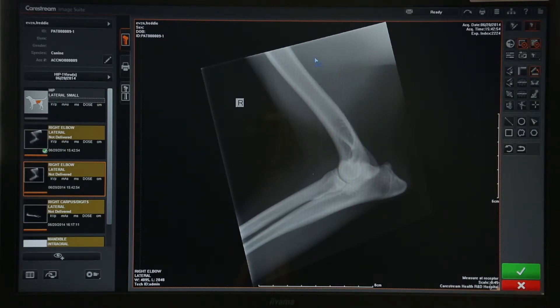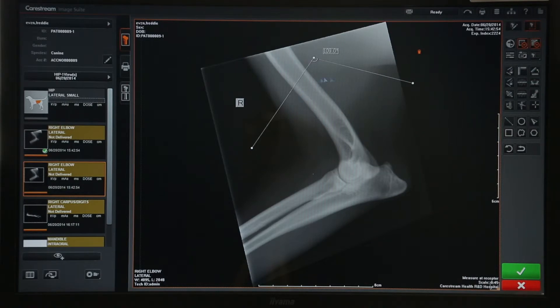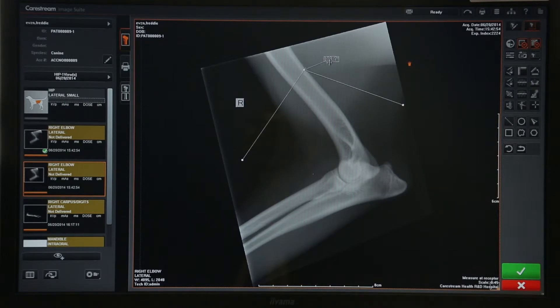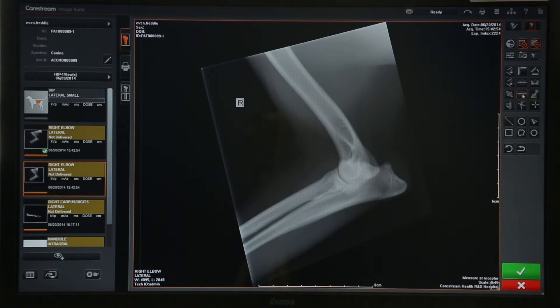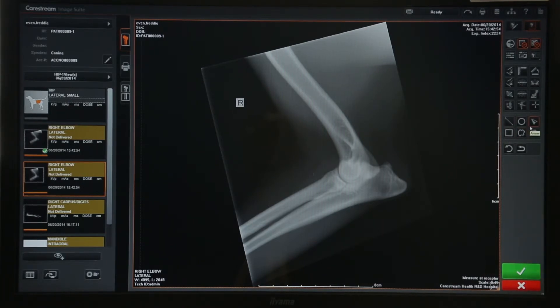This is also where you find angle — the first point you click is the corner of the angle and then you can stretch that out to wherever you need it, and if you've made a slight mistake you can always tweak and move it around the screen. You also have other advanced tools like your vertebral heart score and hip display tools, which obviously aren't much use on an elbow image. You also have an undo button, a reset button, and some icons for drawing if you need them.